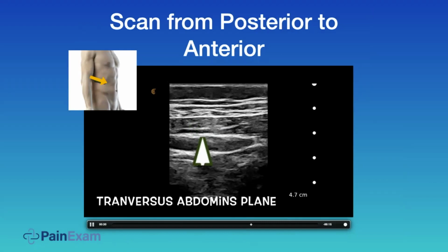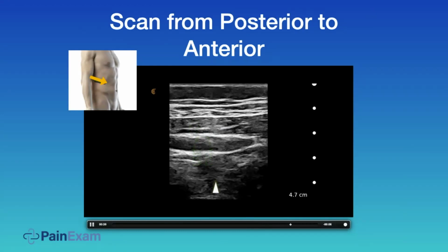And that's the target. You see that's a little thicker here than this level. This is because there's nerves here. This thickness is a nerve. Oftentimes when you stick a blunt needle in here, or a sharp needle, usually a blunt, you get a paresthesia. And the bowel is down here, so don't touch that.